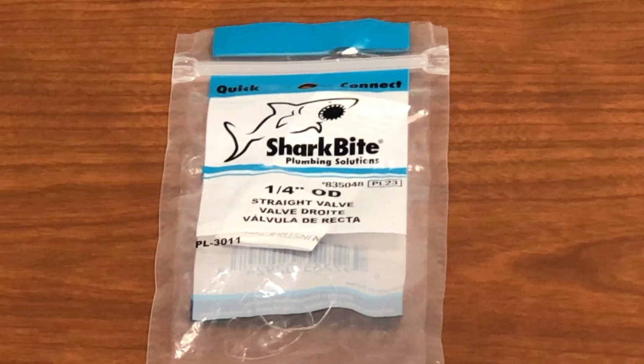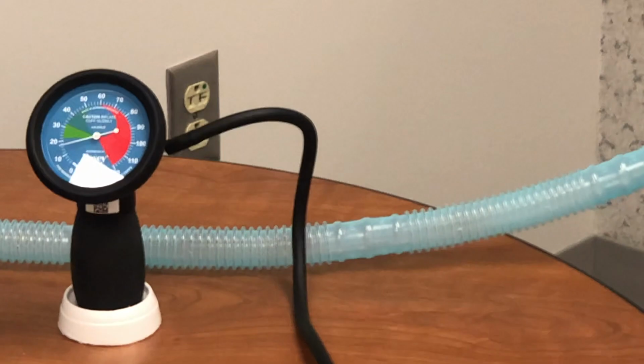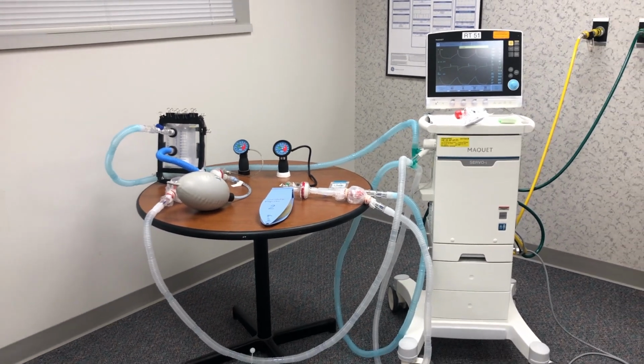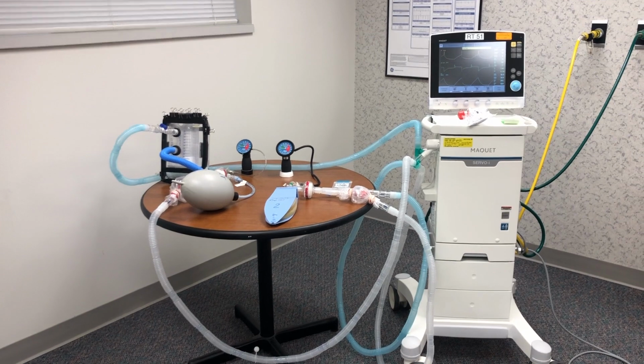This is a 1/4 inch ball valve. Everything is available in the hospital and nothing has been taken from outside. Of course, I got the box from outside, but I think if you search enough, you should be able to find a box in the hospital.